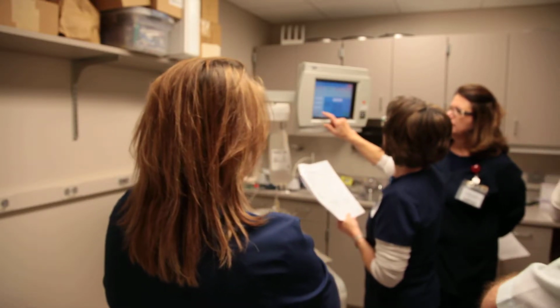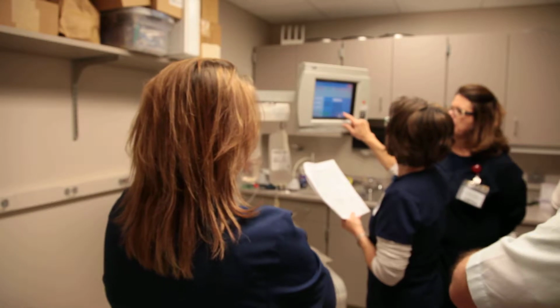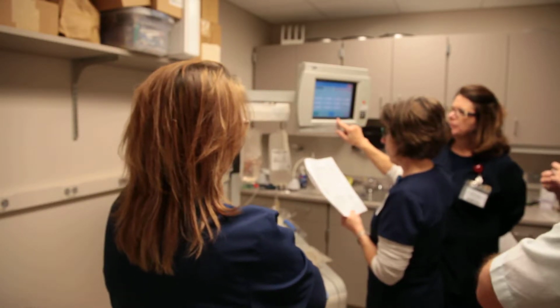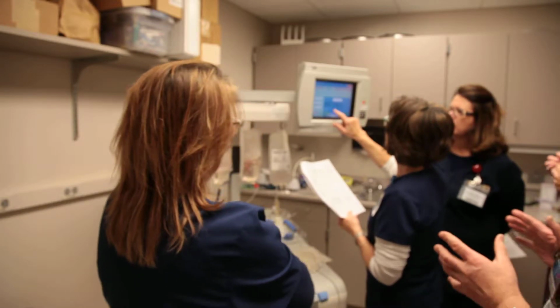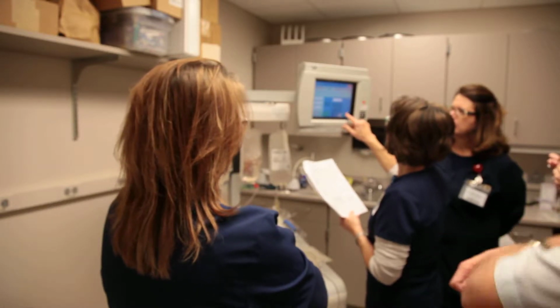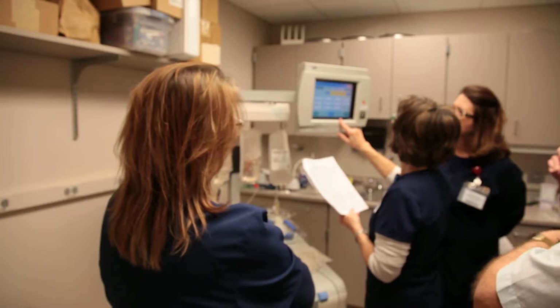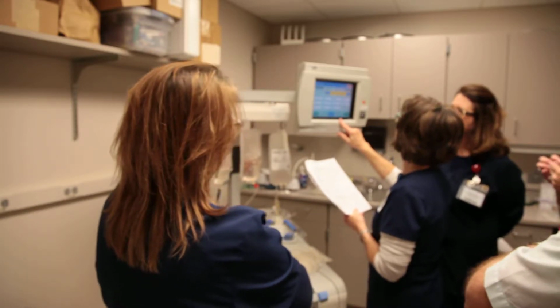And the reason that I use a 750 here is because you're only going to have a few cycles. You'd have 8 at the most. And I don't want to put all our eggs into one basket. I would rather have more cycles because there aren't going to be that many total, so you still won't be dumping a lot of red cells.